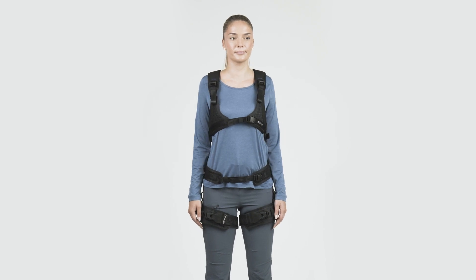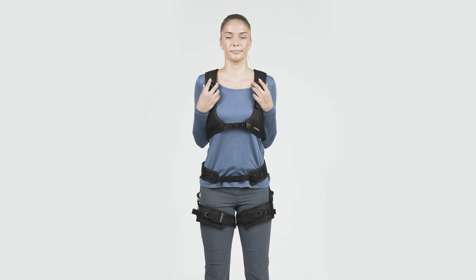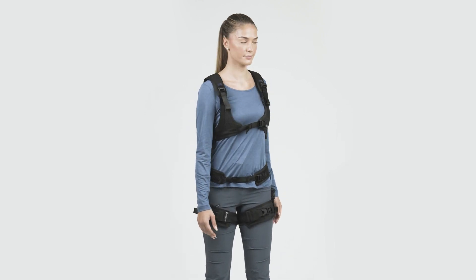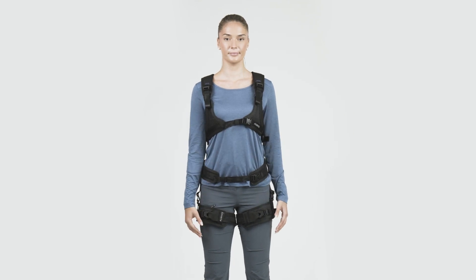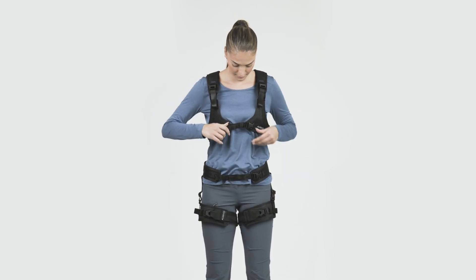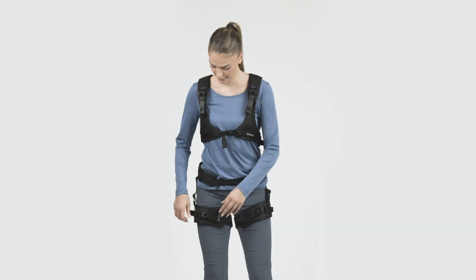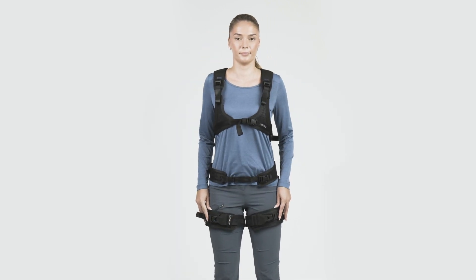Once you wear the LiftSuit, you can adjust the fit to optimize comfort. Bend forward, rotate your upper body, inhale deeply, and see if the suit is well connected to your upper body and thighs, but still comfortable to wear. Readjust the fitting if necessary by further tightening or loosening the straps. We also advise you to readjust the fitting again after some use to compensate for minor shifting of the Exoskeleton on your body.